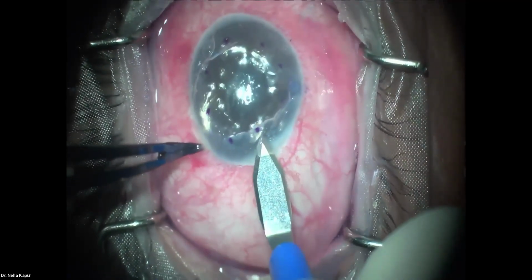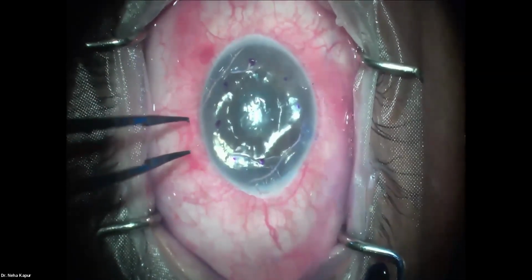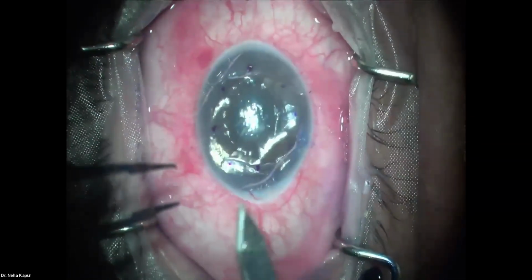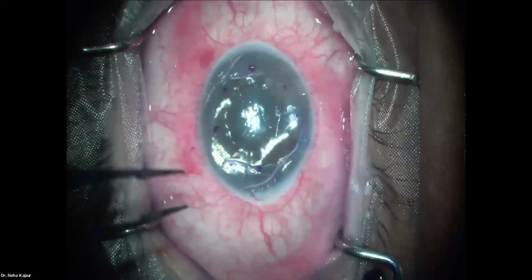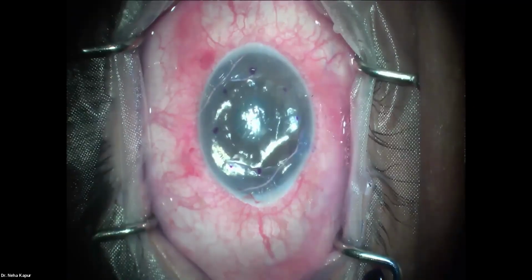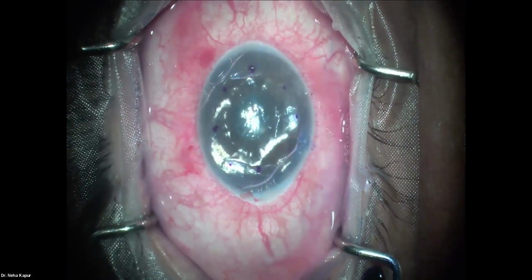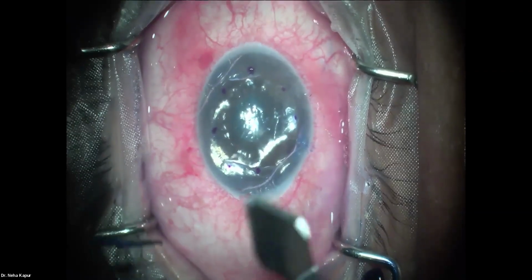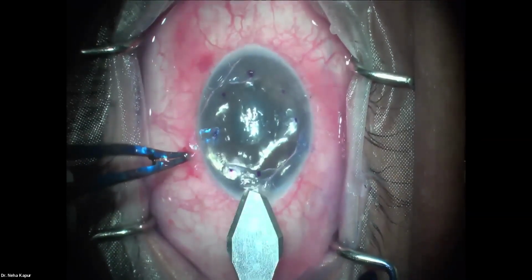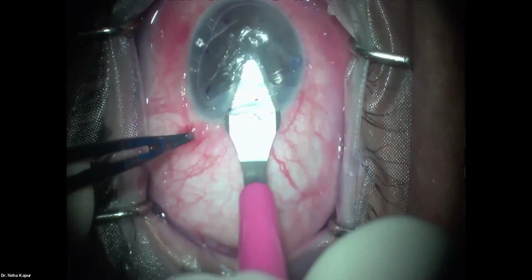A lot of times people like to intersect the entry with the edge of the lenticule. The good thing about it is that the edge of the entry will close against the stromal hydration, and you don't have to put sutures there. But that usually is not our primary intention. The primary intention is to have a well-centered, adequate size lenticule. Even a very long entry may cause trouble.